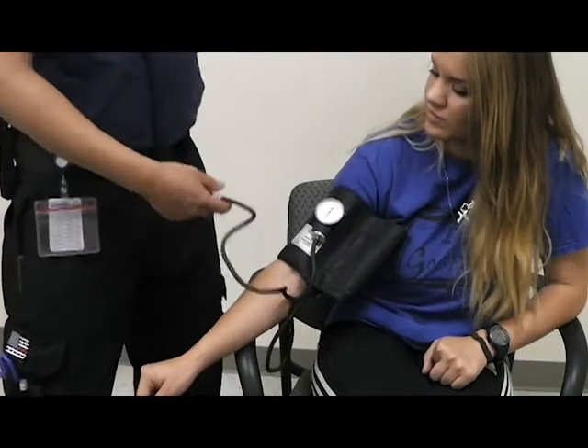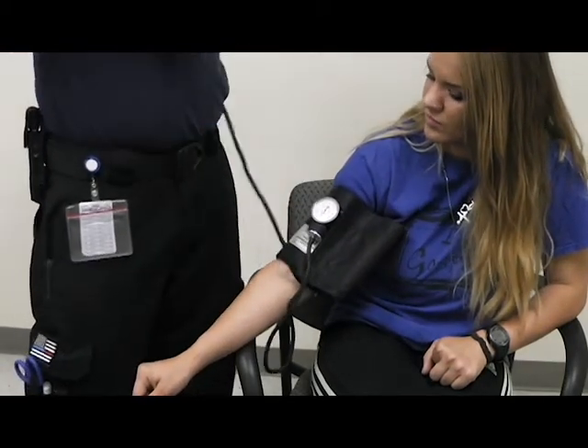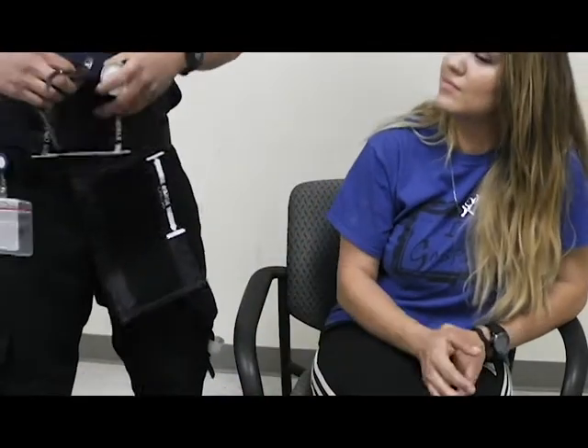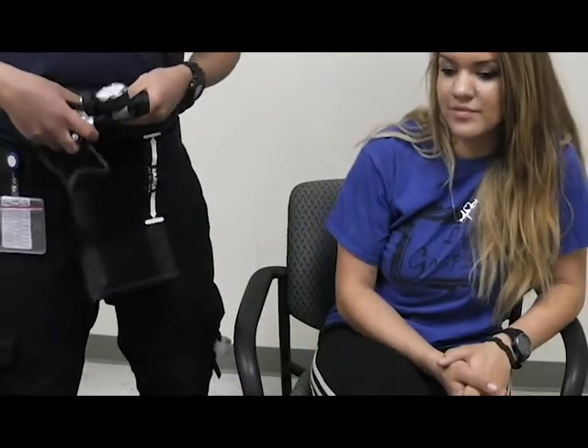In this example, I heard 118 over 82. So 118 would be my systolic number, and 82 would be my diastolic number.